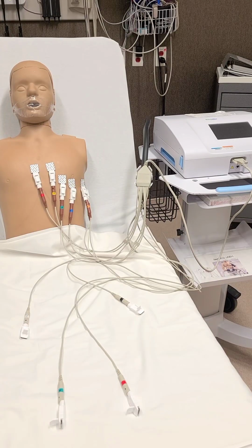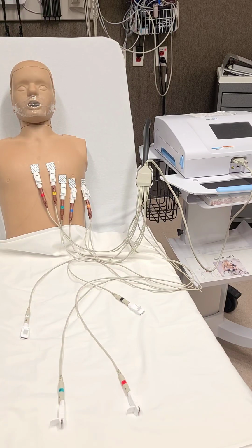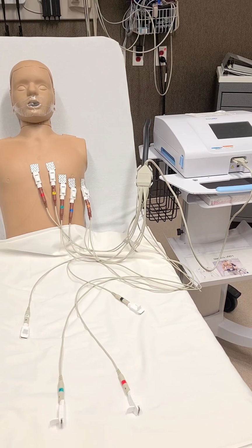So for the limb leads, stick to the forearms and the lower legs. Placement sites should be away from large muscle groups, such as the biceps, because muscle activity can generate artifact. The placement should be uniform, so for instance, don't attach an electrode on the right wrist and the other one on the left upper arm.